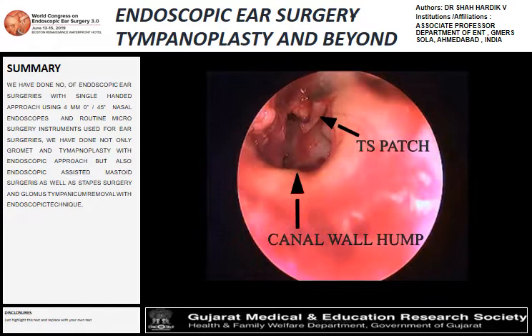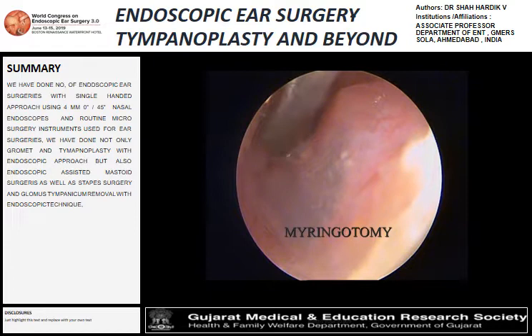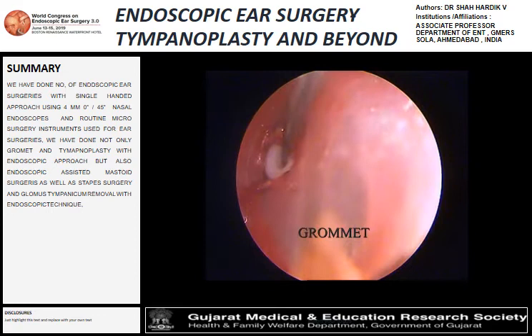That's the placement of the graft. This is an endoscopic grommet incision procedure using the one-handed endoscopic technique. We can see a great portion of the membrane in a single view. With the incision, we remove the glue and place the grommet using routine microscopic instruments that we routinely use for microscopic surgeries.